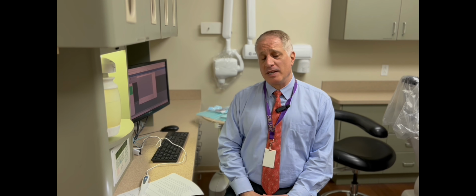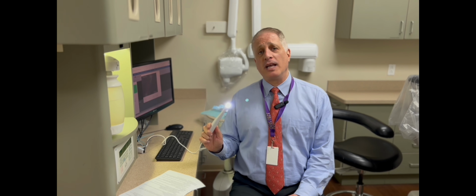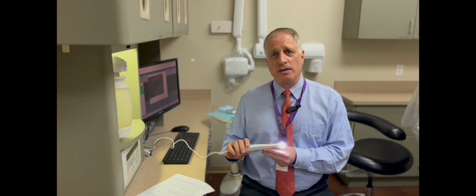The third aspect of the training is to introduce it to the patient. This is not about some high technology gimmick. It's about empowering the patient to get involved in their oral care to lead to better patient outcomes. When do we capture intraoral images? There are 5 instances.